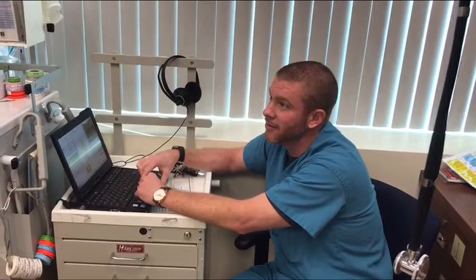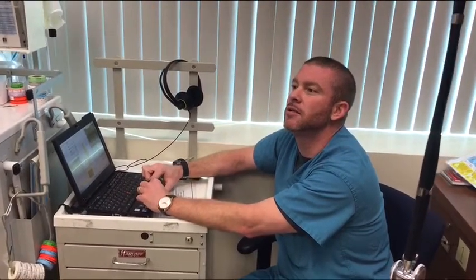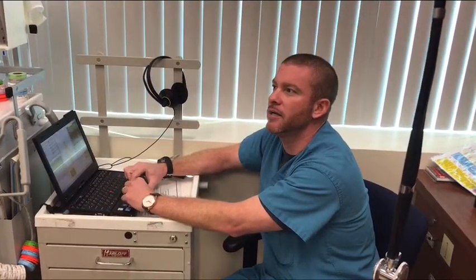Thank you, Carl. You could tell. You could save his life because he needs it. Yeah, that's happening. Oh, that's not good. Sir, we're going to have to back down on that CO2. So I'm trying to get out of here. I got an appointment today.